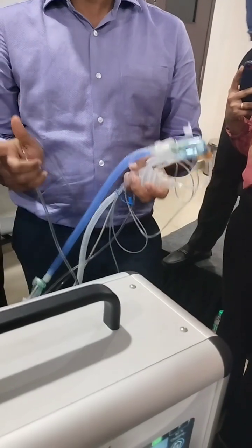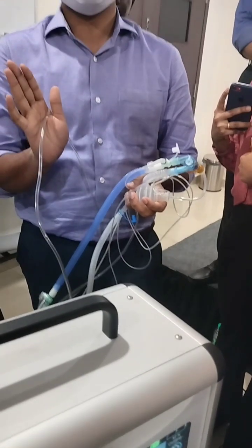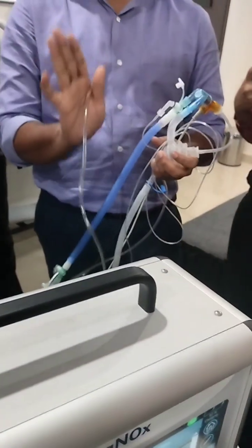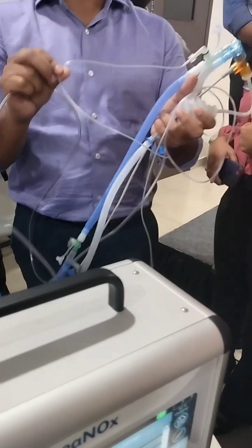Nitrogen dioxide is not good for the baby. If the value of nitrogen dioxide goes above 3 ppm it is toxic, and if it is more than 5 ppm you have to stop the therapy immediately. More than 3 is toxic; more than 5 you stop. This will be displayed on the screen.